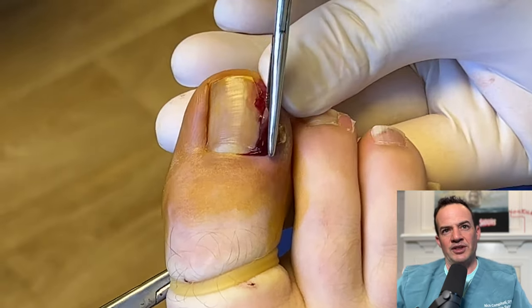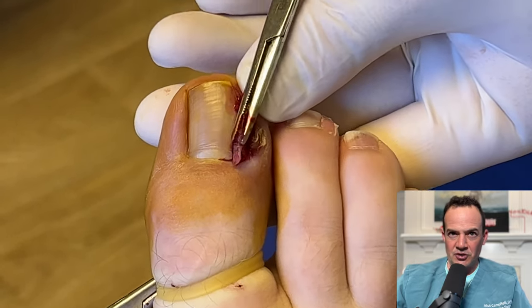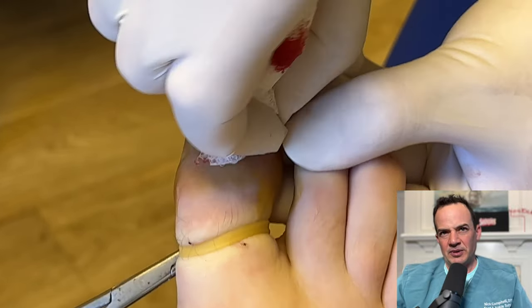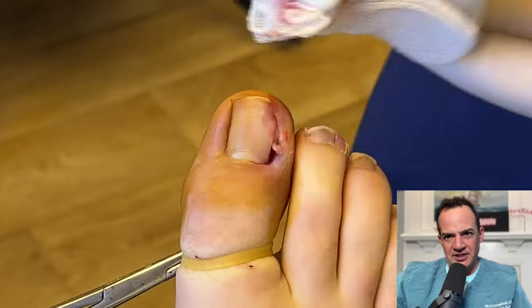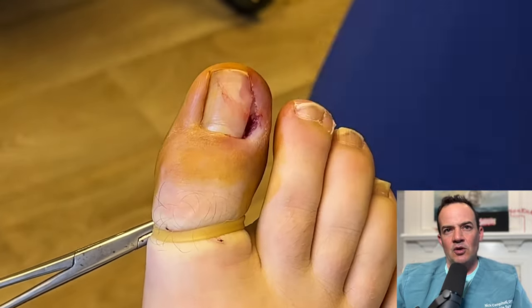The next step after we've cut it with that chisel blade is to remove the ingrown toenail. You'll see we're using some hemostats here and we pull it and it comes all the way out. We want to make sure we got it all — sometimes there'll be some debris remaining, and that's what you can see we're doing here, removing some of that debris manually with our gauze.